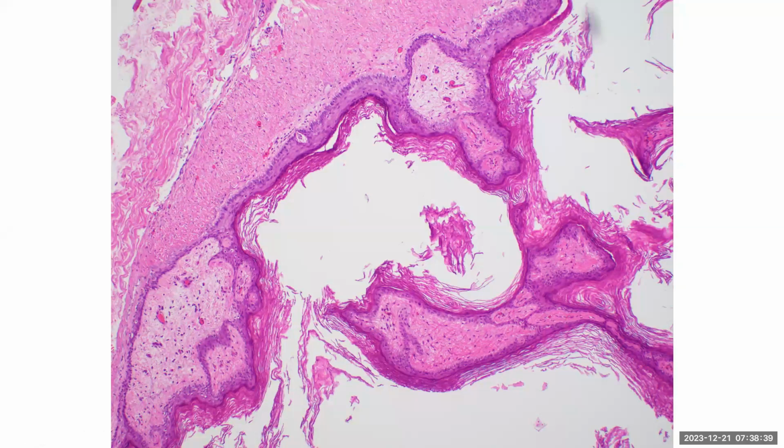So similar attributes here. You can distinctly see the basal layer of the squamous epithelium here. Again, epidermoid is skin-like, and then you can see the keratinization at the top, which again sloughs into the lumen of this cystic structure.